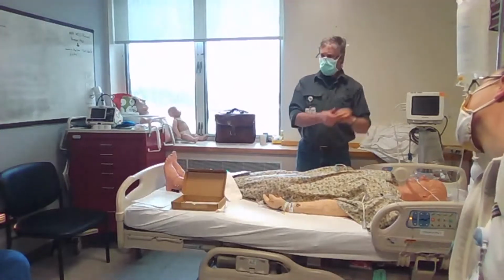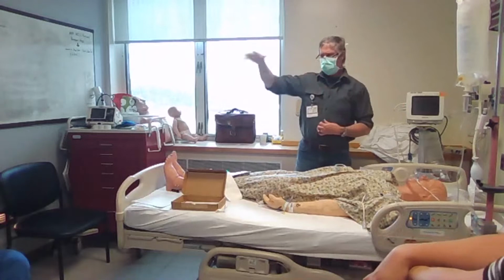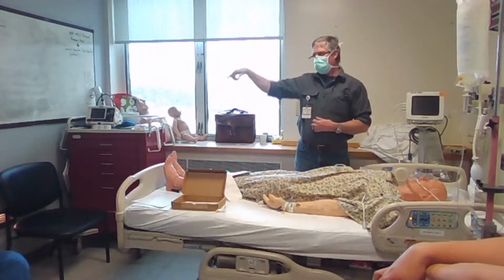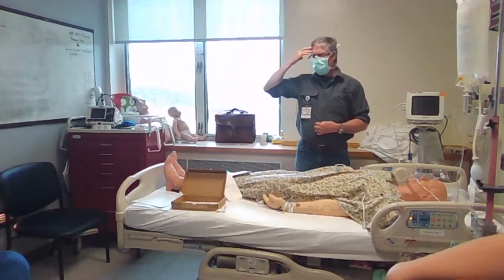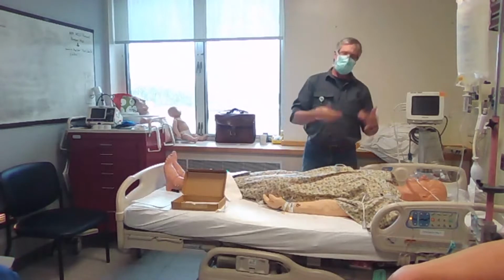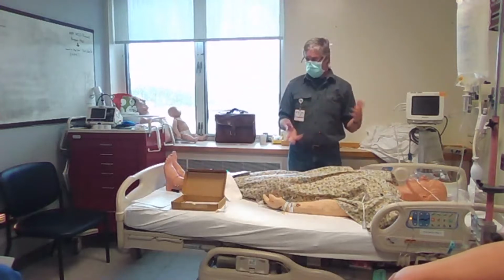But once you close it, you're going to start dampening your system, most likely. So you just won't get the same readings. Because you'll notice as the bag goes down over time, like if you're in a long case, you're going to have these really great waveforms in the beginning. And an hour later, they're going to be half the size, and you're going to go, wait, are they losing blood? No. Did something else happen? No. Oh, it's my bag. And then you pump it up again, and everything magically corrects itself. It's great.